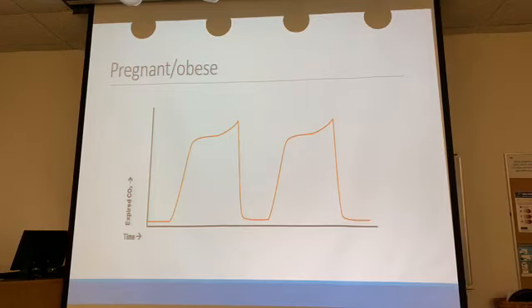All that pressure causes those alveoli to collapse very quickly, and you get this surge of carbon dioxide that gets pushed out of their alveoli at the very end of exhalation, as the weight is causing all those small bronchioles and alveoli to completely collapse. So that's why you should see this uptick all of a sudden in these patients.